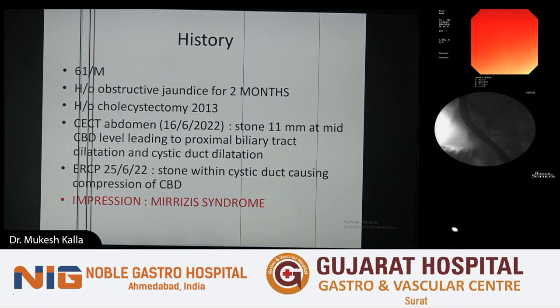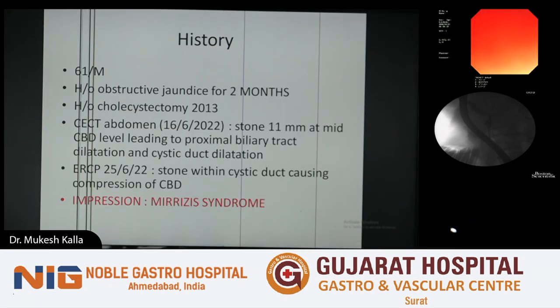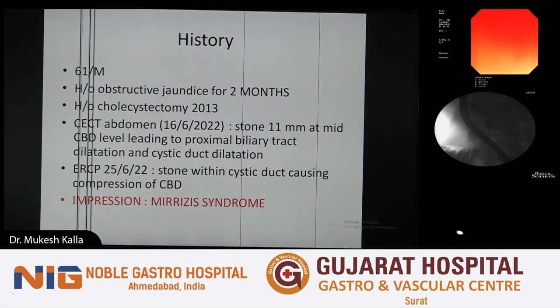And that's why I think I'm looking for options. One of the options that I discussed with Dr. V.K. Mishra in Kanpur is that they do an intraoperative ERCP. The surgeon, during a lap chole, puts a guide wire from the cystic duct into the papilla, and then the ERCP person comes and does the procedure. So there is no pancreatic cannulation, just to avoid a pancreatic duct cannulation. These are some of the novel ways we can both club together and reduce the risk of pancreatitis. I think that should be one of the ways we should be thinking about.